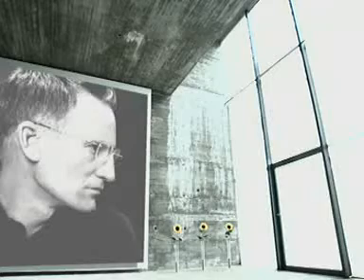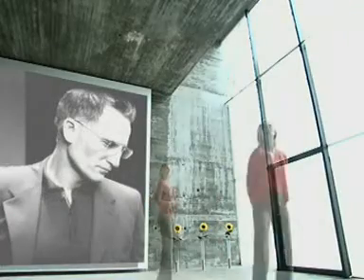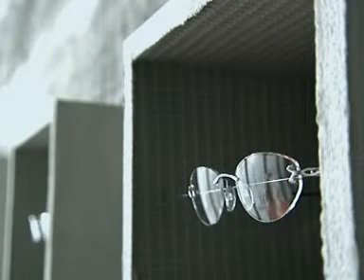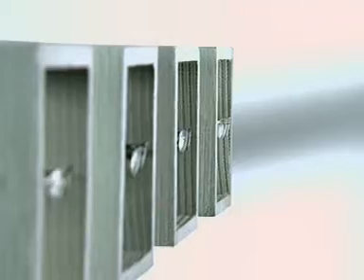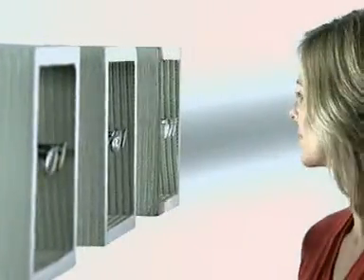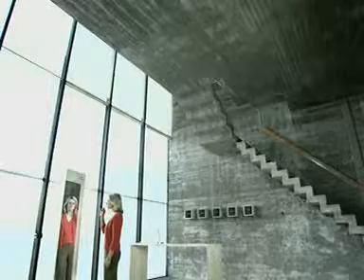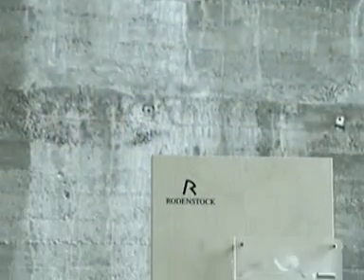Impression ILT progressive lenses. Simple measurement, individual fitting. Every person is different. Every face is different. The distance between the eyes, the shape of the nose, the position of the ears, all features which are unmistakable. And all features which have to be taken into account in the surfacing of progressive lenses and the fitting of the spectacles to guarantee optimum vision. Rodenstock has made this vision reality. ILT individual lens technology makes individually optimized progressives possible, which make vision a unique experience.